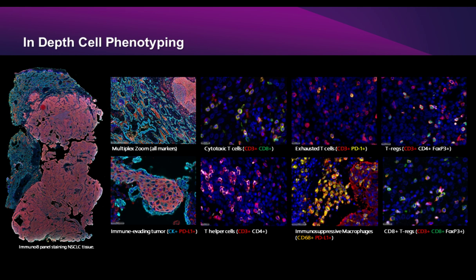So I could just talk from our experience. We did take a really quick look, or a close look, at multispectral imaging technology. There's a lot of good things about multispectral imaging, but some of the challenge with it is that it's very sensitive to the expression of each marker and its proximity to each other. One marker can easily overbalance another marker, and it makes it tough to balance. So there's a lot of optimization that needs to be done.